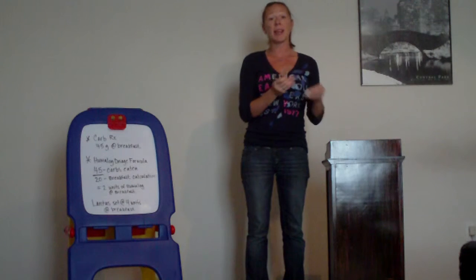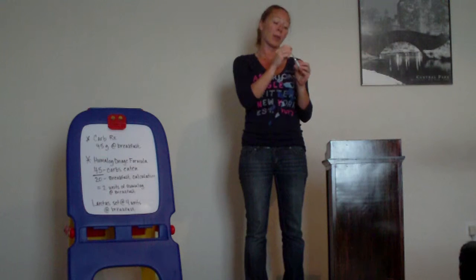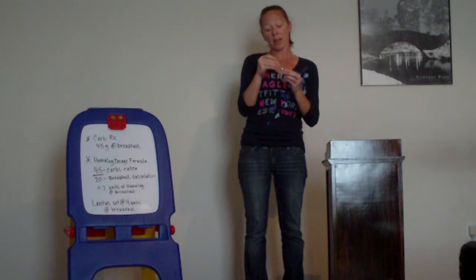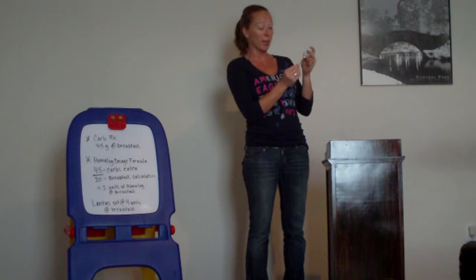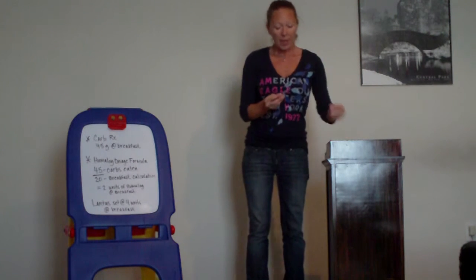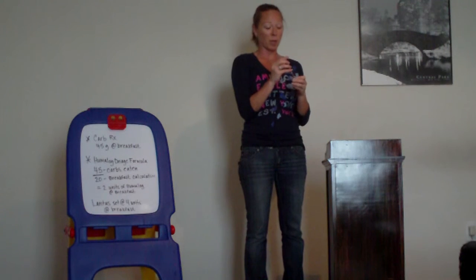And you're going to put this in the long-lasting vial. This is to create an air movement so that you don't have a tight suction as you're trying to draw in the Humalog. Then you will pull back 2 units of air and pump it into the Humalog.